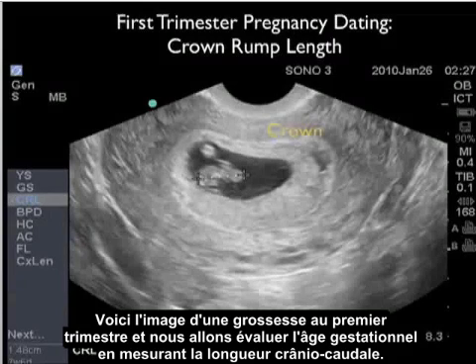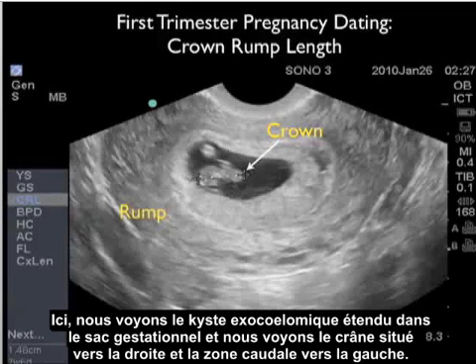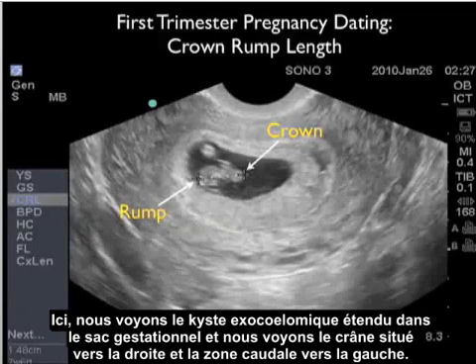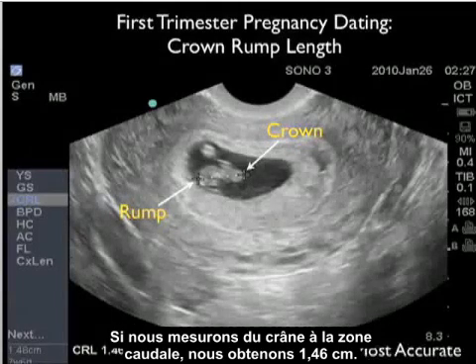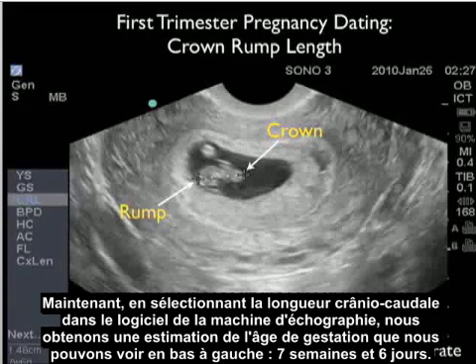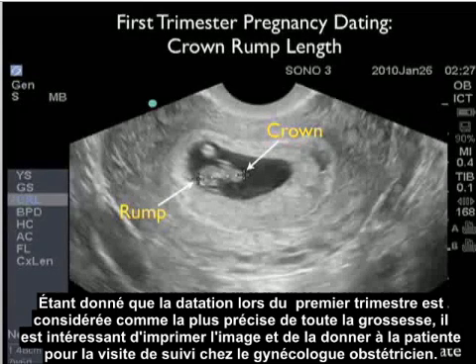This is an image of a first trimester pregnancy, and we're going to evaluate the gestational age by measuring the crown rump length. Here we see the fetal pole stretched across the gestational sac, with the crown located towards the right and the rump towards the left. Placing the calipers from crown across to the rump gives a measurement of 1.46 centimeters. By selecting crown rump length in the software package on the ultrasound machine, we get an assessment of gestational age — 7 weeks and 6 days. As first trimester dating is considered one of the most accurate during the entire pregnancy, it's nice to print this image out and give to your patient for their follow-up visit with their OBGYN.